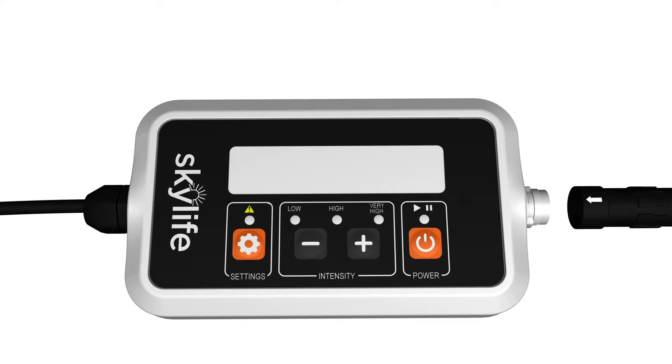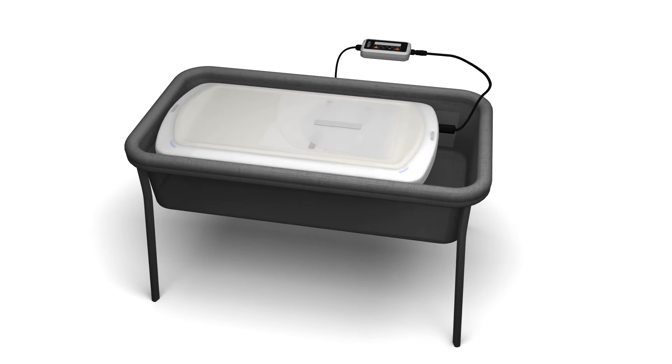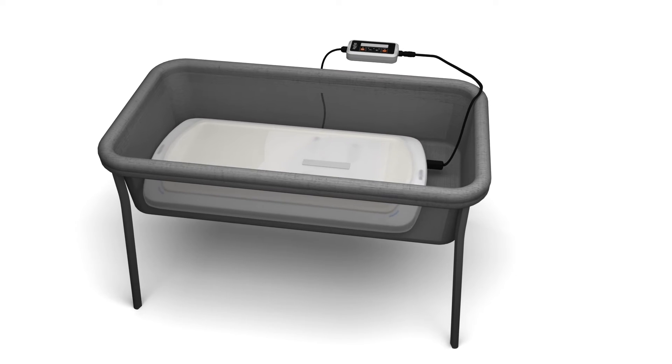Attach the controller and power supply to the device. Plug the power supply into the wall outlet. You are now ready to place the SkyLife device into a crib, bassinet, or incubator.